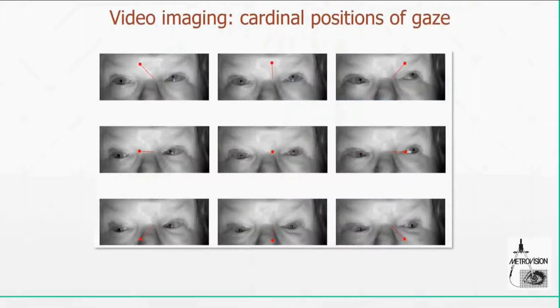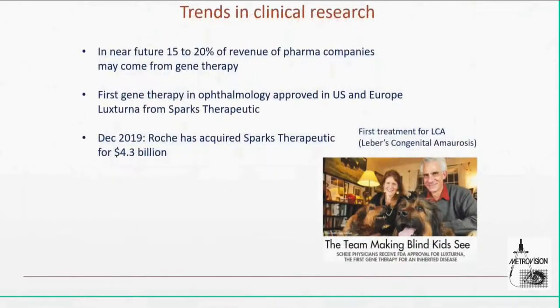Video imaging also allows us to do recordings of different positions of gaze and quite a number of other applications. I will go about this in details, maybe in some other presentation. Now, our topic today is more related to clinical research. And I did want to put some of this introduction.